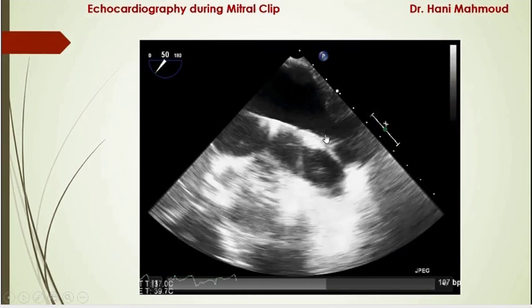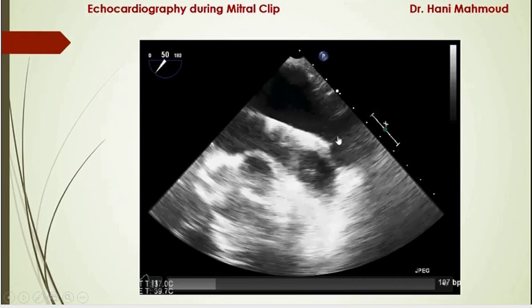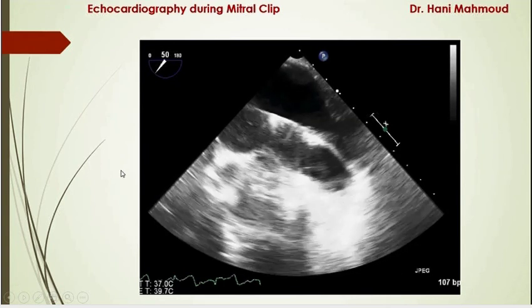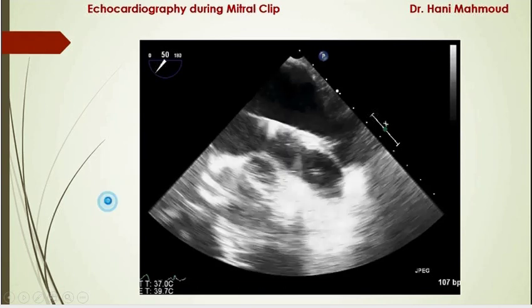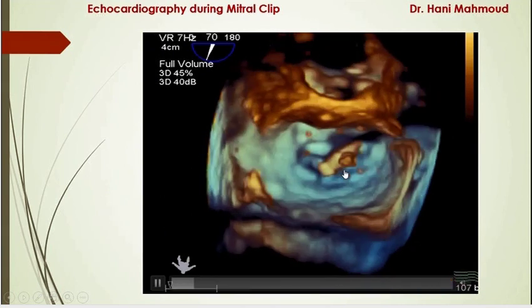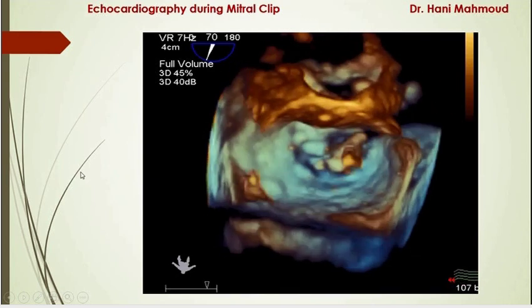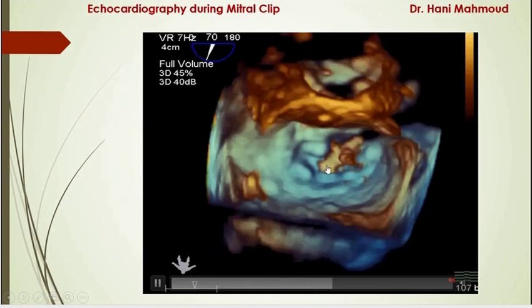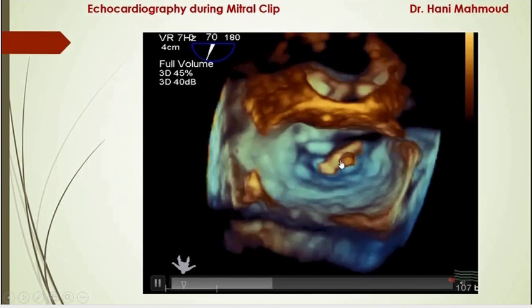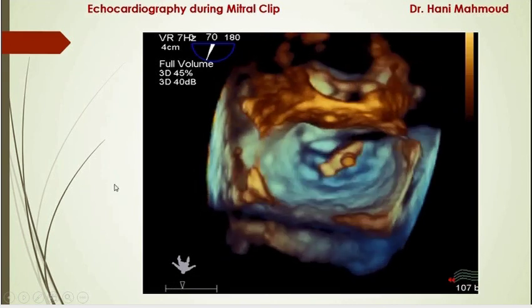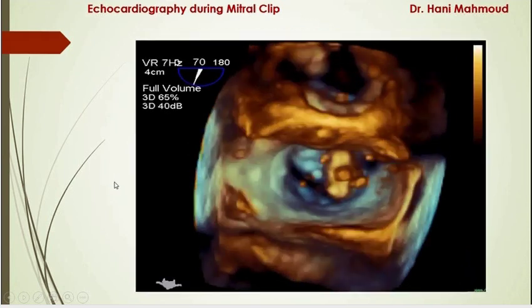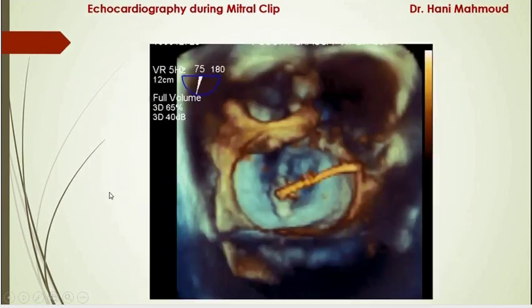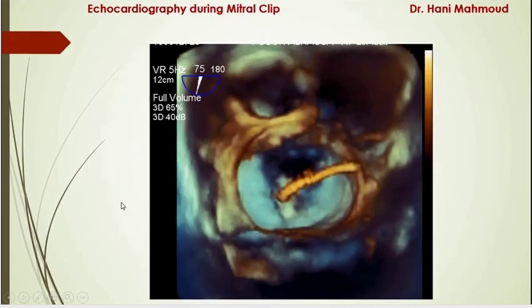The clip came out and was lying over the Coumadin ridge, near the left upper pulmonary vein and left atrial appendage. We showed this to the interventionist, who then moved away from the Coumadin ridge by pulling back the sheath slightly and moving medially or laterally until the clip was above the mitral valve. Then, back to 3D to check perpendicularity — a very important step and one of the incremental values of 3D during mitral clip procedures. The clip was oblique relative to the mitral leaflets, so we told the interventionist to rotate anticlockwise. He rotated but was slightly anterior, then adjusted posteriorly to a suitable position.